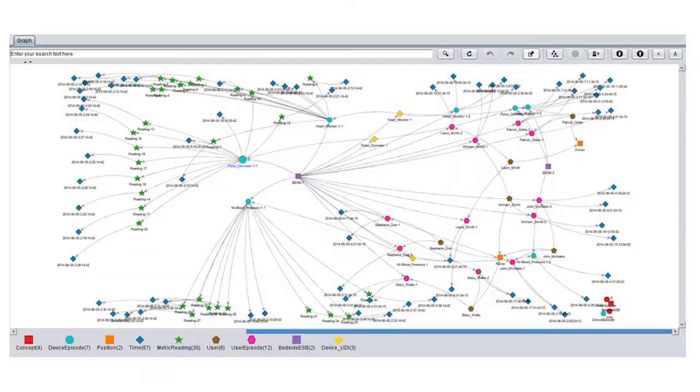Some of the work that we have is, this is an image of a subset of the data model. The data information model is being developed jointly by DocBox and Mass General and other collaborators through some defense and NIH funding, to look at what this data model and this information actually looks like. This is a tool that we borrowed as open source out of the DoD, that they've been using for infrastructure analytics going forward, called CMOS.